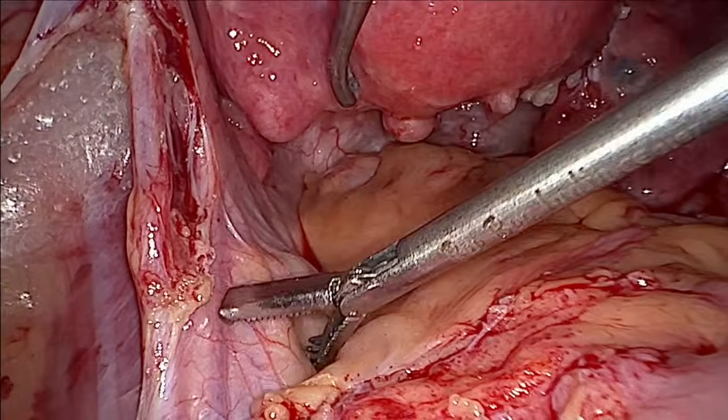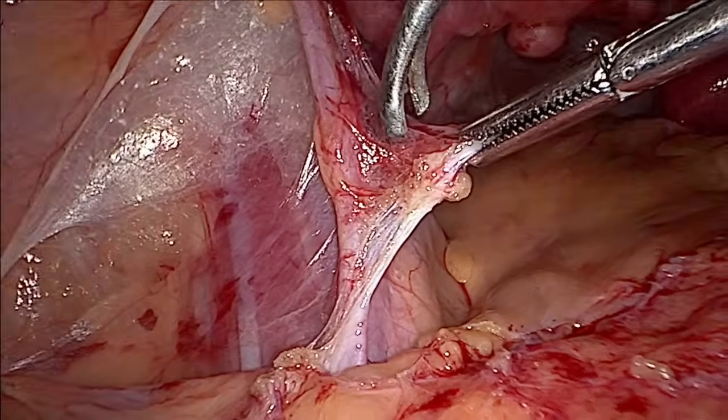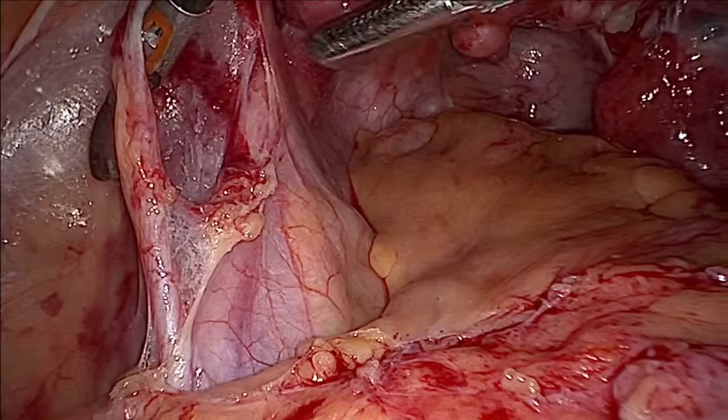Now we can see the ureter here. I will just hold this peritoneum. You can continue the live stream, that's not a problem. I think the issue has been resolved.